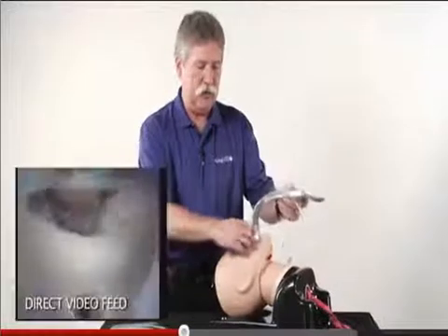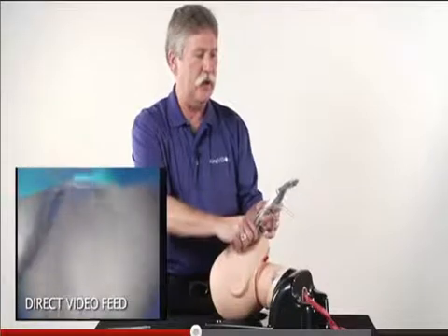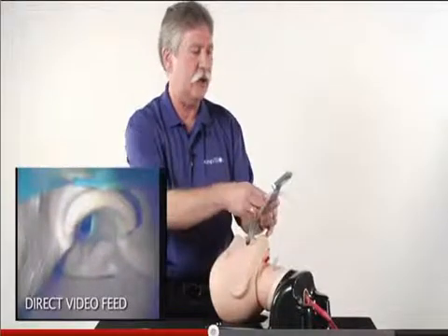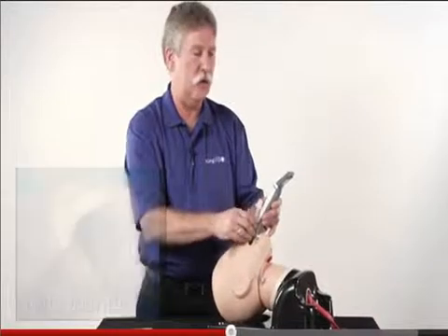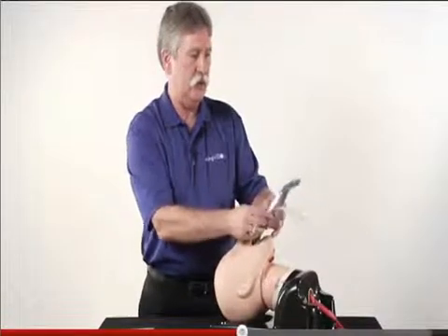In introducing the channel blade into the mouth, as we've talked about previously, it's good to follow the base of the tongue and visualize the epiglottis, and even put the tip in the vallecula, much like a Macintosh blade. As you advance the tube, you can get a little fine control to advance the tube, center it so that it goes towards the vocal cords. And if you want to capture a long floppy epiglottis, again, you can get a little fine control with manipulating the tube to center it going through the vocal cords.